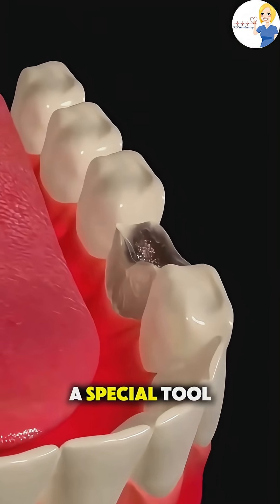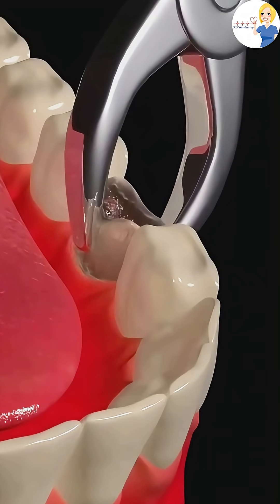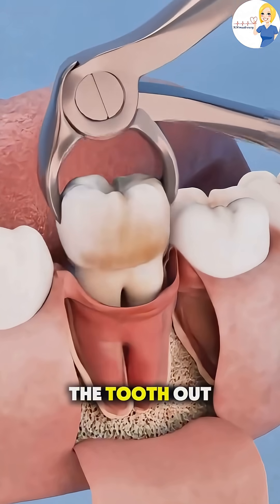the dentist uses a special tool called an elevator to gently loosen the tooth from the socket. When it's loose enough, forceps are used to carefully lift the tooth out.